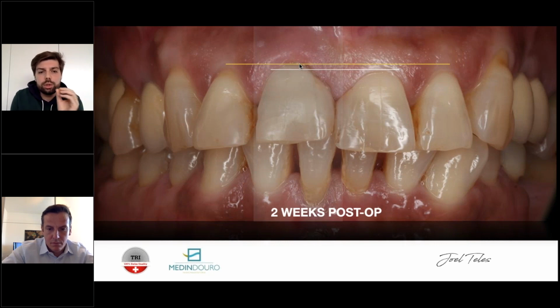This is only due to one thing. While I was preparing this crown, this provisional restoration, I was looking at this profile. So I was not placing my implant and making my provisional restoration thinking about where this was. I was thinking where this was. And this is the thing I told you at the beginning: up to a certain point, and if you are experienced, you can play a little game with biology, trying to make it work to your advantage. This is a typical case of that.